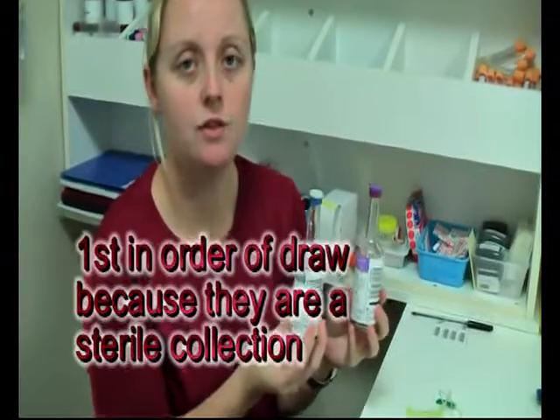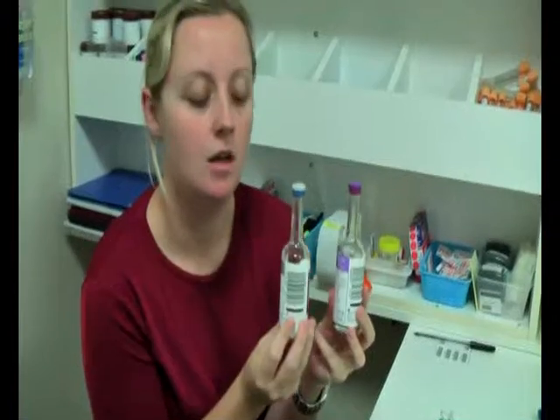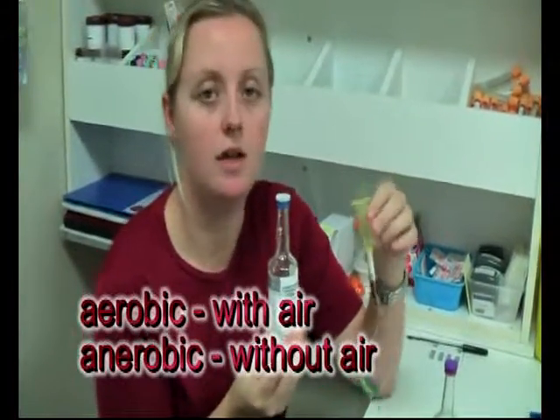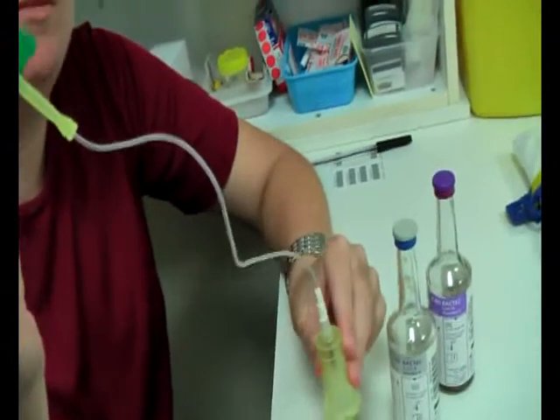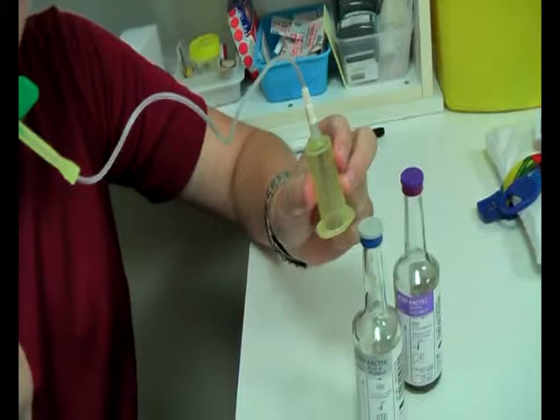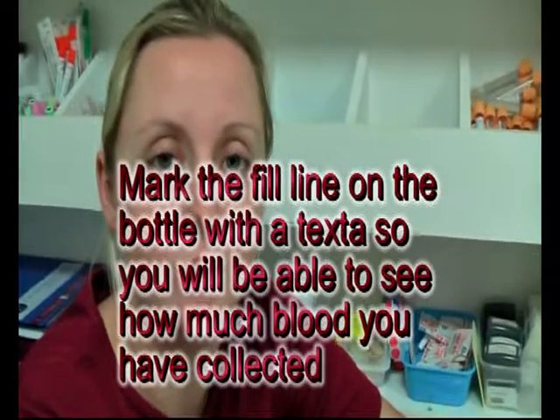Blood cultures are always first in order of draw. They come with 2 bottles in a set. We always do the aerobic bottle first because we use a butterfly during this collection. We always do the aerobic first because of the air in the tube. We're going to be introducing air into this bottle and it won't sacrifice the test. If we were to put the anaerobic on first, we would introduce air into that bottle and the test would be compromised.